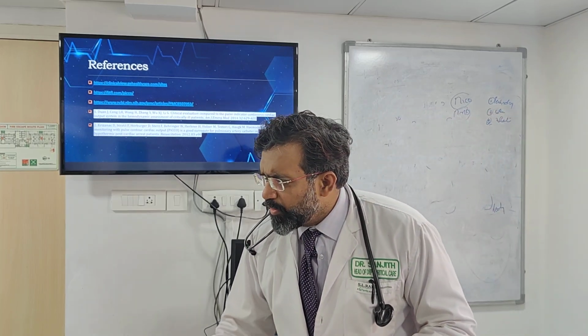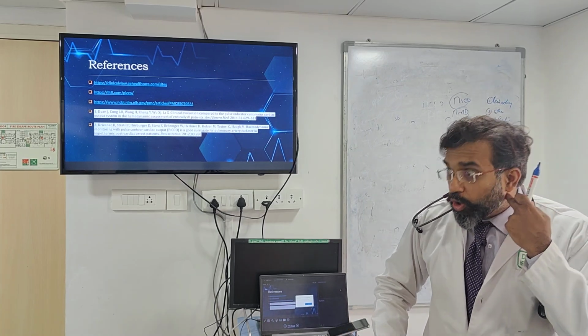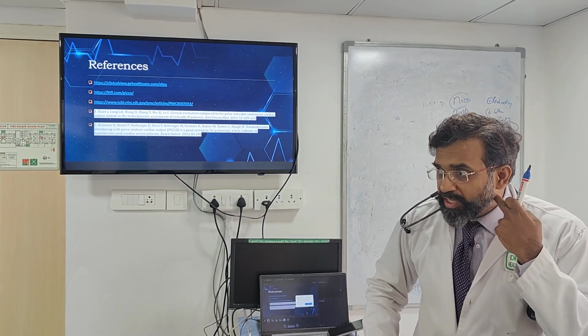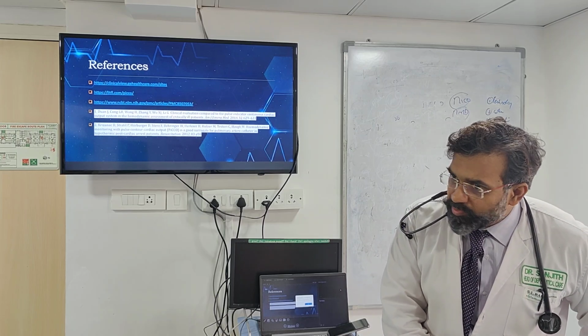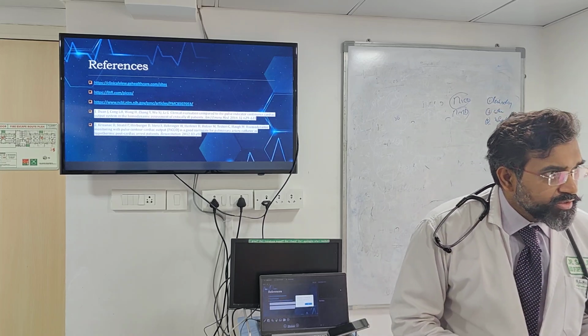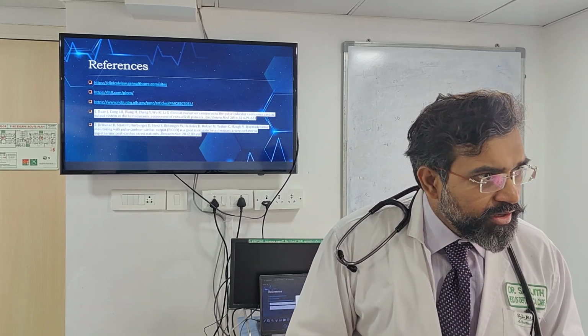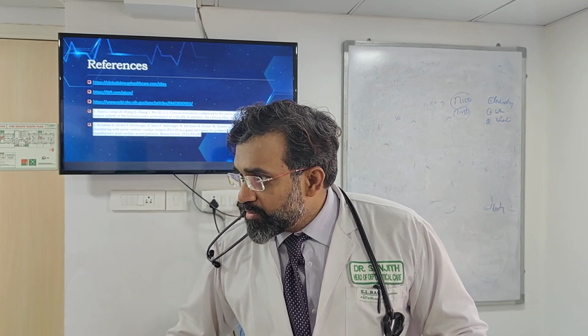Are you understanding? Simple it is. So if the orientation of this were wrong... If I want to put a dialysis line, I'll put my dialysis line here. I'll put my central line here. I will not change this orientation. You understanding? I'll put my central line either here or here, and my arterial line here.